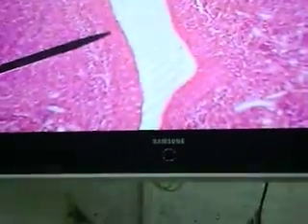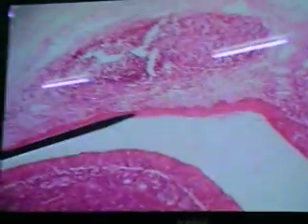So it confuses the normal cytoarchitecture of stratified squamous. Over at this part here you see classic stratified squamous epithelium. But as we trace it down here, you can see the lymphocytes are literally passing through. So it's just infiltrated with lymphocytes.